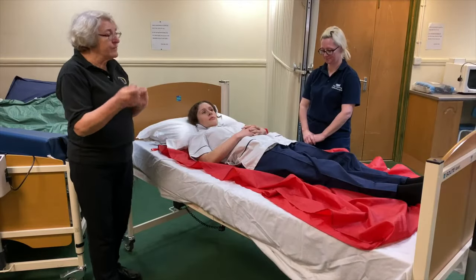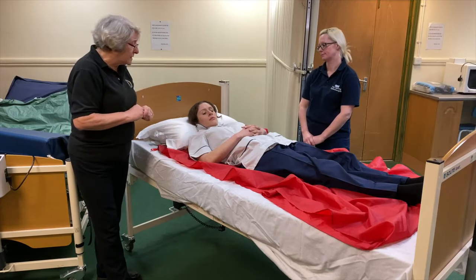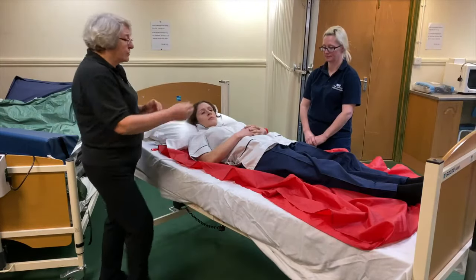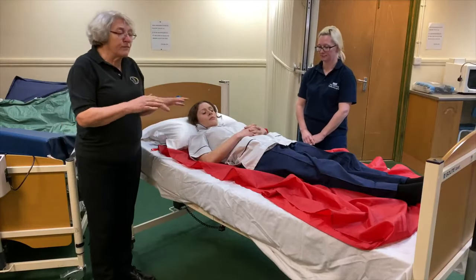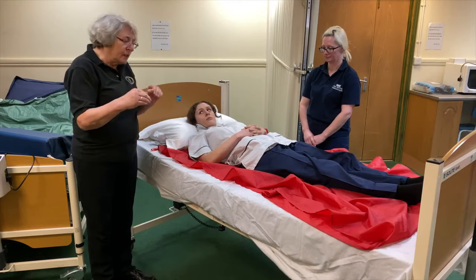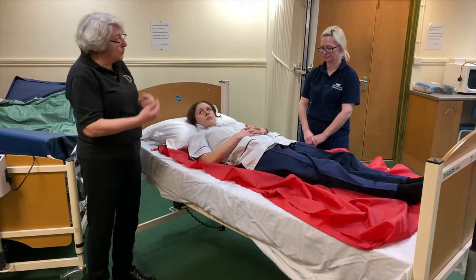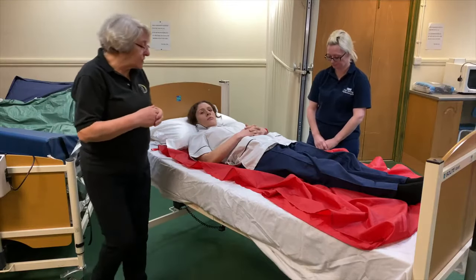Okay, so we've done supine slide up the bed with Alice. However, this time her turning chart says she needs to be in left lateral lying, side lying. So we have to get her into position to be in the side lying, or what we call 30-degree tilt. That means that I'm going to pull Alice across to me on the slide sheet, and Lisa is going to help with the pull.